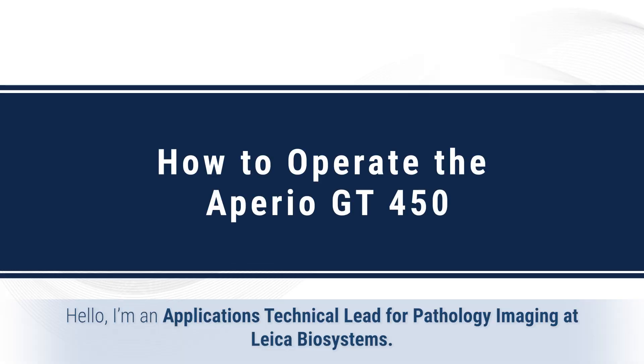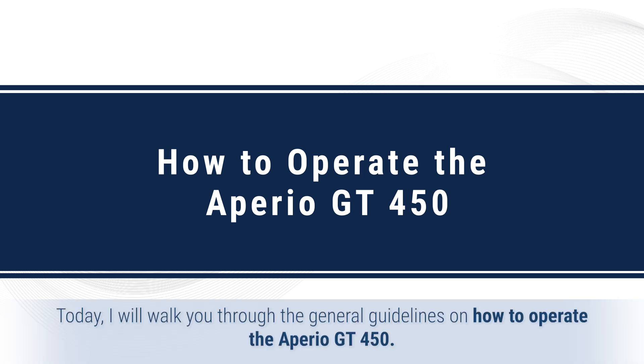Hello, I'm an application technical lead for pathology imaging at Leica Biosystems. Today I will walk you through the general guidelines on how to operate the Aperio GT450.